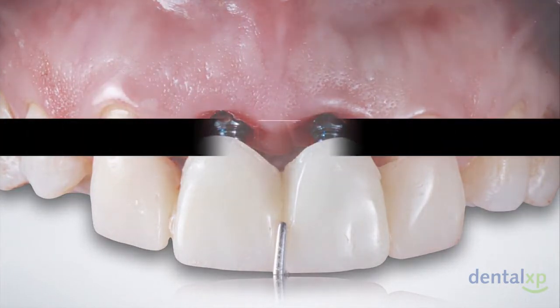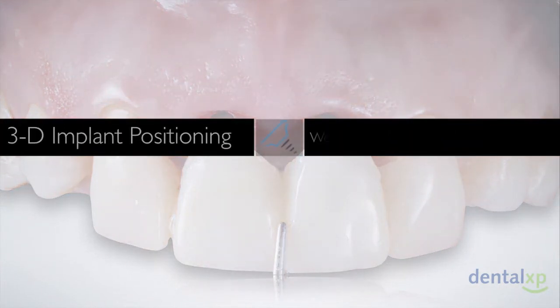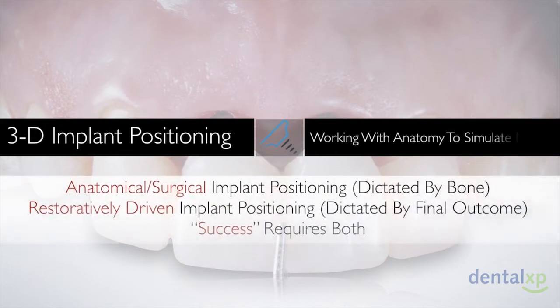So with regards to the three-dimensional implant positioning, essentially we're working with anatomy to simulate the natural appearance of the final restoration. Not only do we want to place our implants in the desired restorative position, but also we need to conform to the available anatomy we have in the site. Therefore, a balance between both anatomical and restorative considerations is really necessary to achieve our desired outcome.